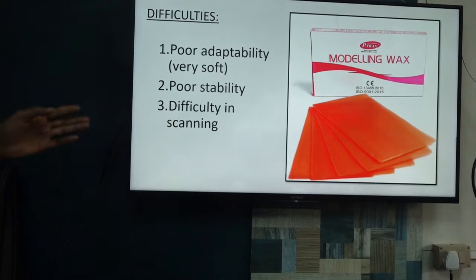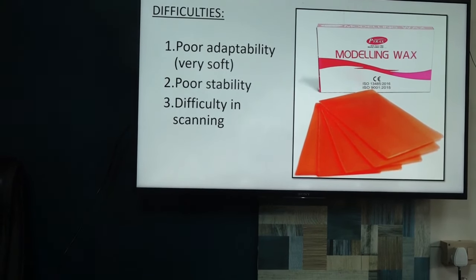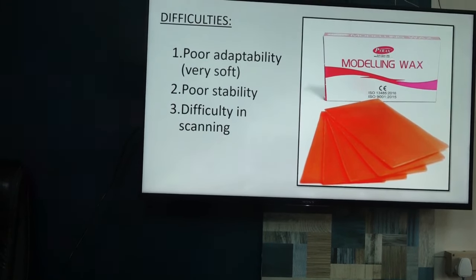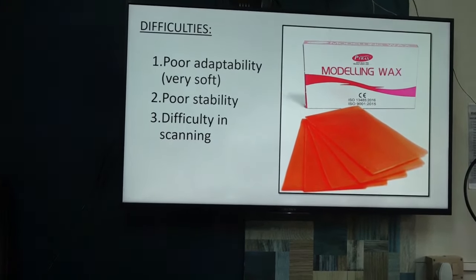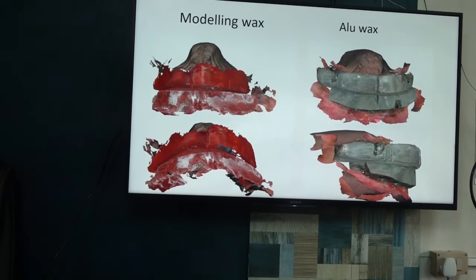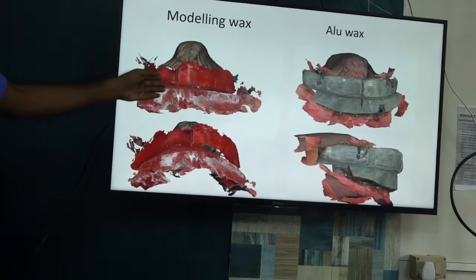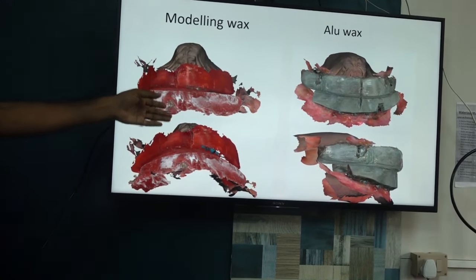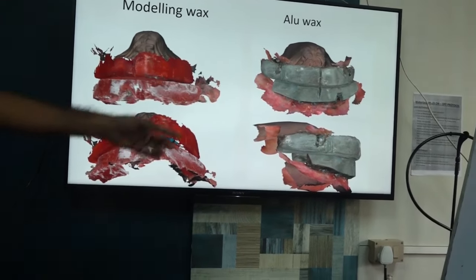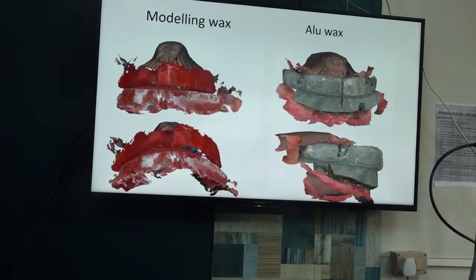So the problems with the red wax: the adaptability is very poor, the stability is not good, it will move, and there is difficulty in scanning also. Okay, so anyhow, we are not using this, the previous one. When you use modeling wax, then you need to use scanner spray and all. Right? So with this we get a clear, good scan of the alu wax.